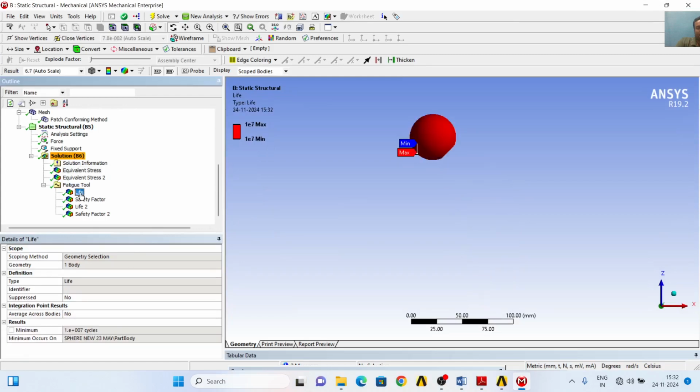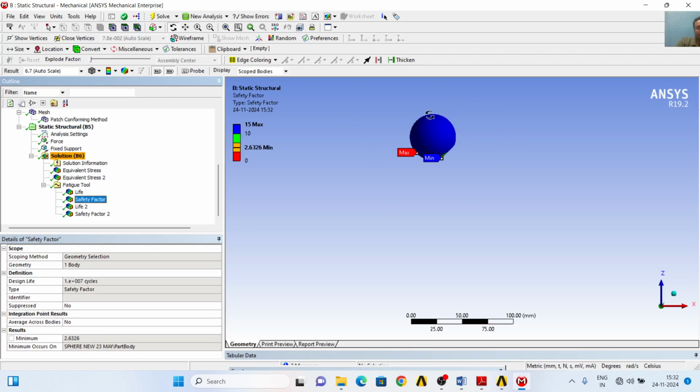With life of head 1e7, 10 to the power 7 life cycles, the head is going to survive. And what will be the safety factor for head material? It will be 2.6326, which is far higher than 2, which is considered to be a good safety factor. For mechanical designs we generally take a safety factor of 1.5 to 2, and this is 2.6, which is far higher than 2, which is considered to be the safest design.